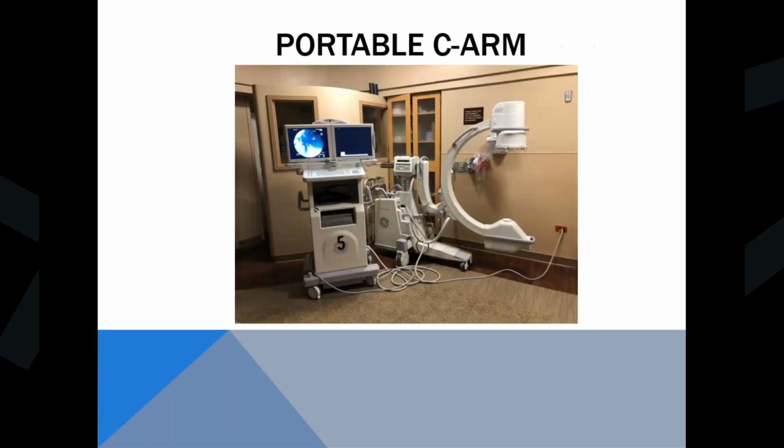Okay, so here's kind of an introduction for a lot of people to the world of fluoro. You'll see these guys hanging out all over the OR. You might see them in some of the special procedure rooms up in radiology, but 9 times out of 10, you'll be seeing them up in the OR.